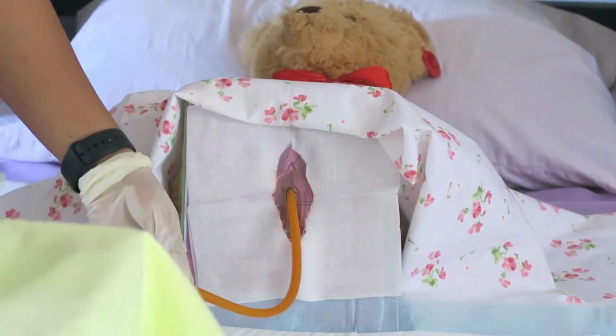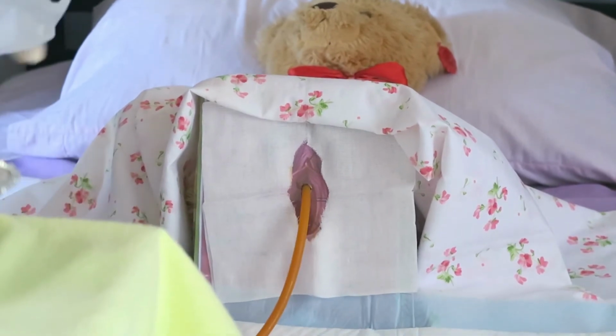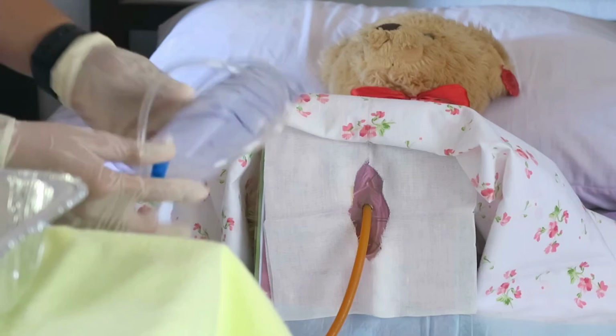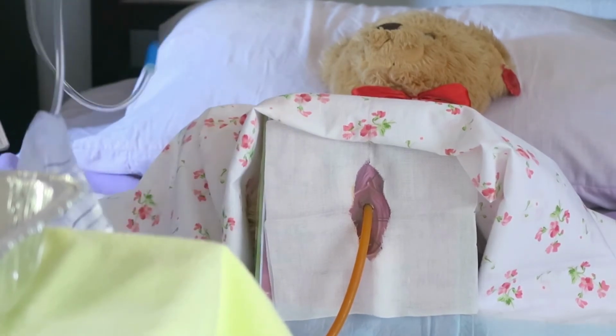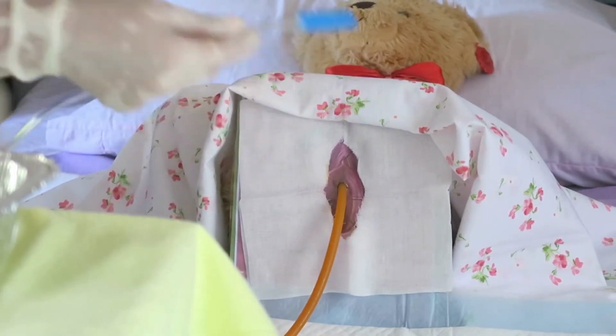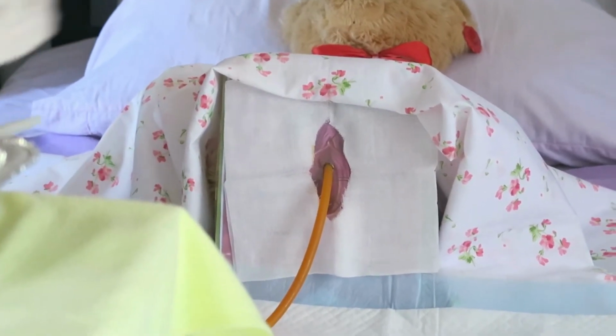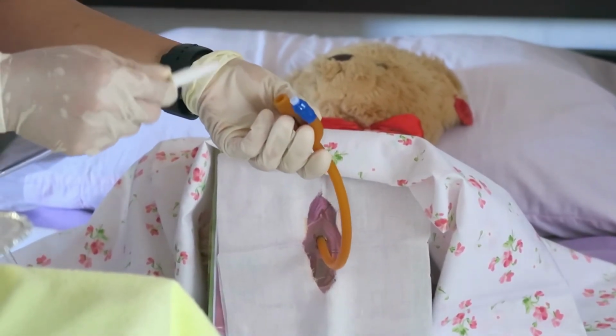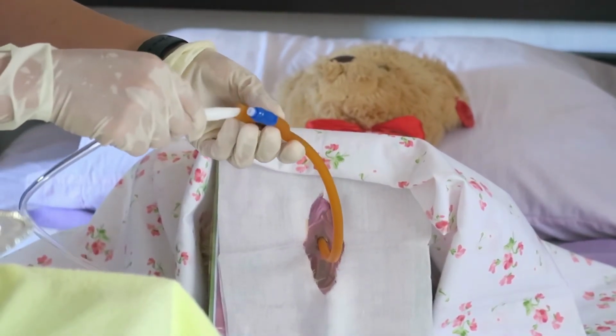So this is the urine bag. Then it starts. I will connect the urine bag to the catheter.